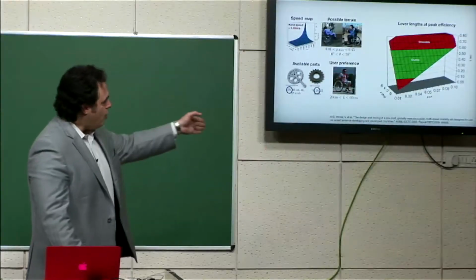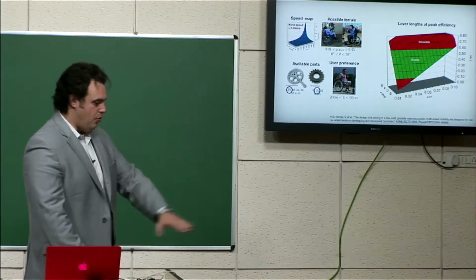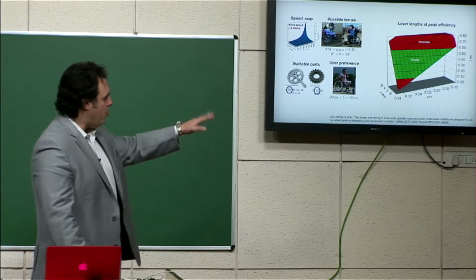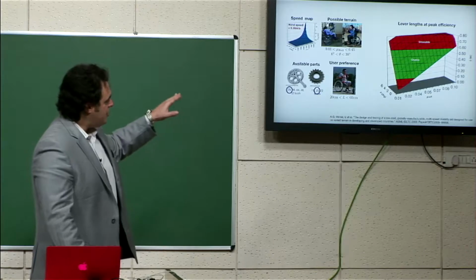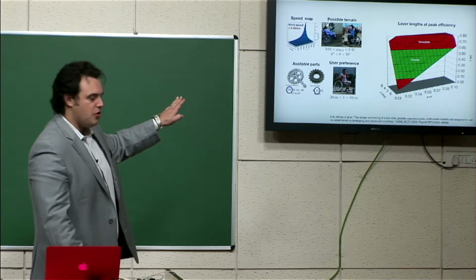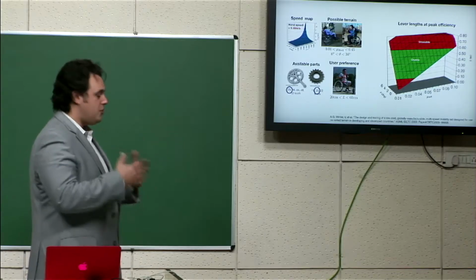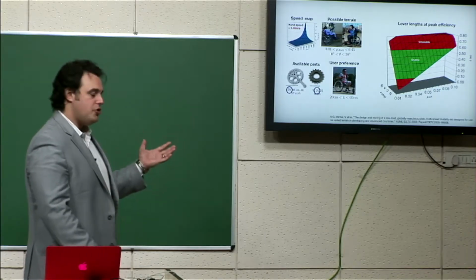So that rolling resistance would correspond to smooth terrain like this, all the way to a gravel road, which would be about a 0.1 coefficient of rolling resistance, and a climbing angle up to about 6 degrees, or about a 10% grade. So this was encouraging that in most situations where you drive, this wheelchair should work pretty well.